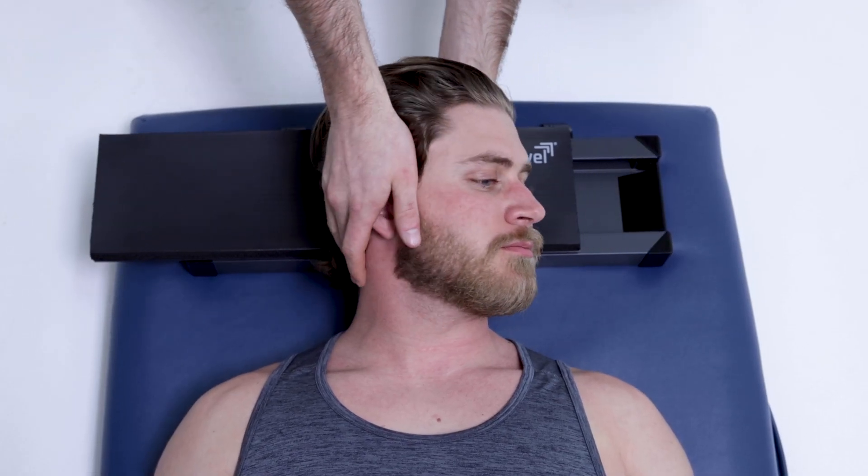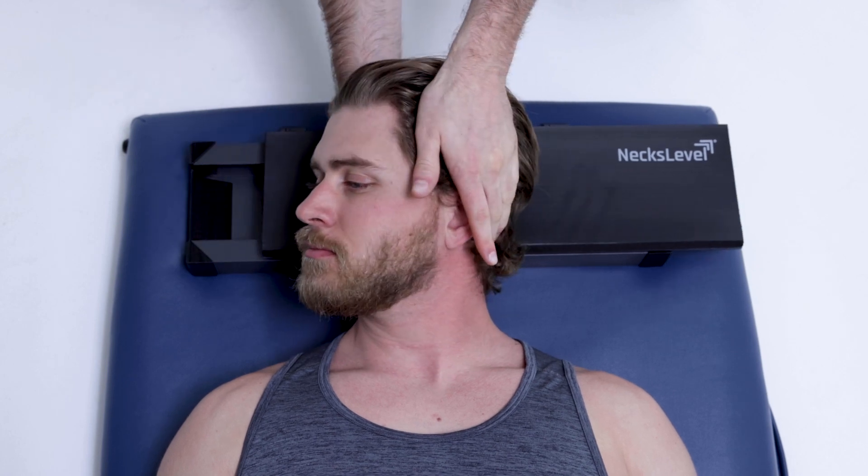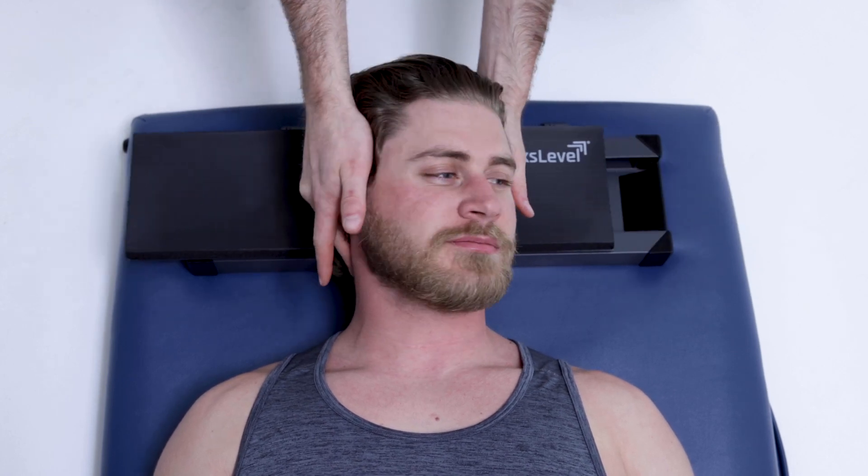Whether a user is guarded and fearful of movement or just stiff as a board, performing passive range of motion on the next level device can unlock their stiff neck.